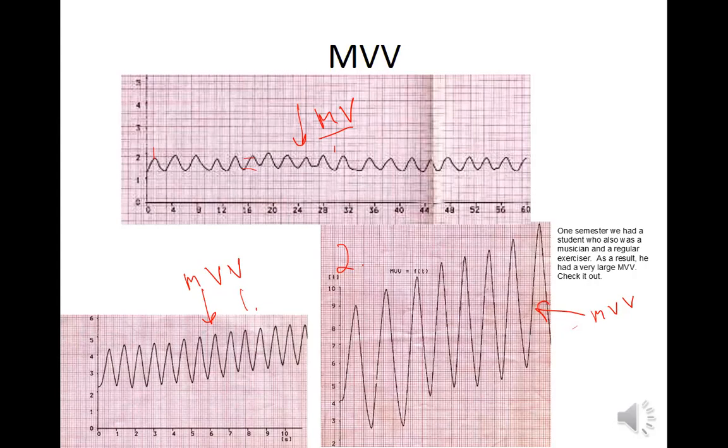Right? So you're looking at volume here. You can get the volume. I know it's a little off, but you can do the volume of each of these breaths over 10. You'd have to multiply it by 6 to get, right? Because this is liters per minute. This is done over a minute. This is important. But you know MVV is liters per minute. And still inhalation first. So your outcome is going to be different.